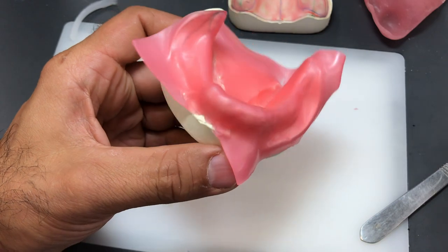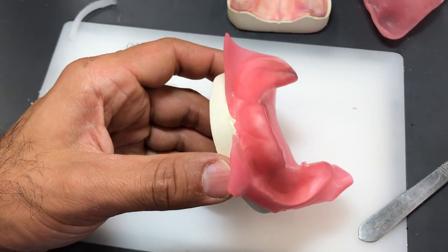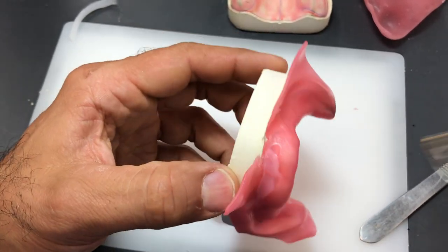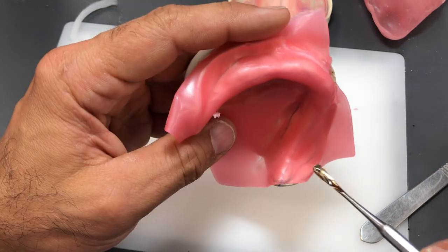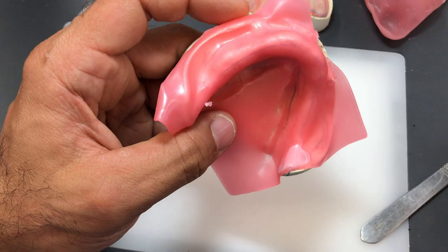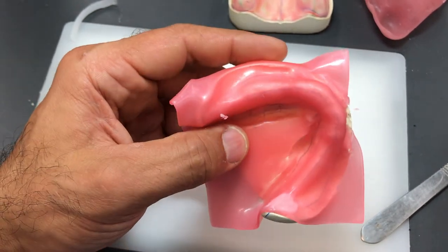So before I cut it back, I'm going to assess it. And I think right here, I'm a little bit wide. Kind of folded against itself, or I guess I did it. And I'm going to add some here over the retromolar pad. I think I just pinched it a little bit heavy, or maybe the wax was a little bit too soft in that area, and as I was applying pressure, it thinned out on me. But that's the beauty of wax. You can go back and manipulate it and change it.